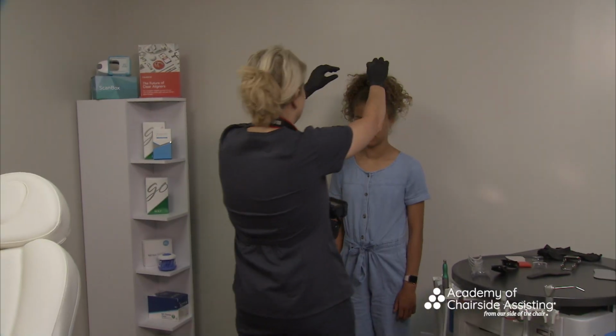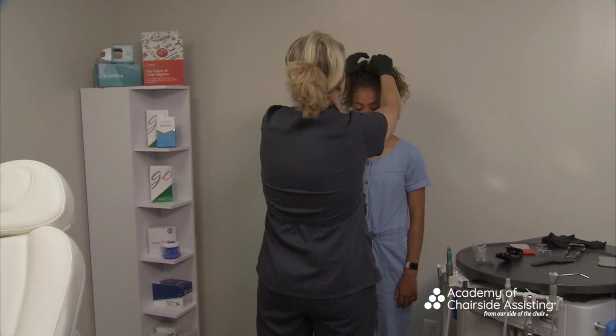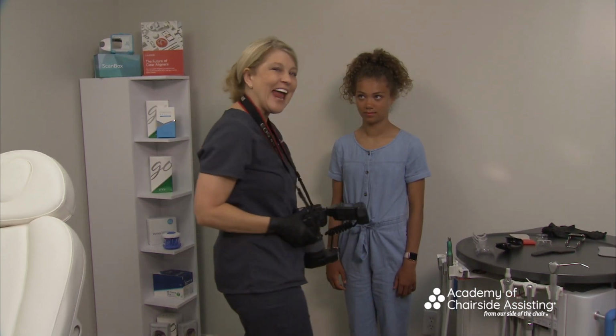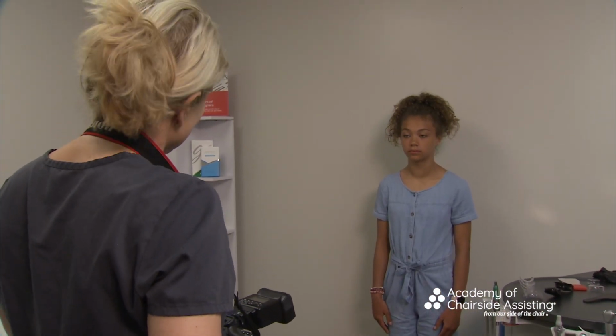Now, I want to touch on something really quickly. Do you see how her hair is sticking out? I'm really funny about my photos. I don't like that. So I'm going to go to her, and I do this to patients, not just because she's my granddaughter. I'm going to take this and hide it. You got this curly, beautiful hair, but I don't want that to be where a patient's eye would normally go. They'll be like, oh, what about my hair? Or I've got some hair in the frame on my face. So cute.